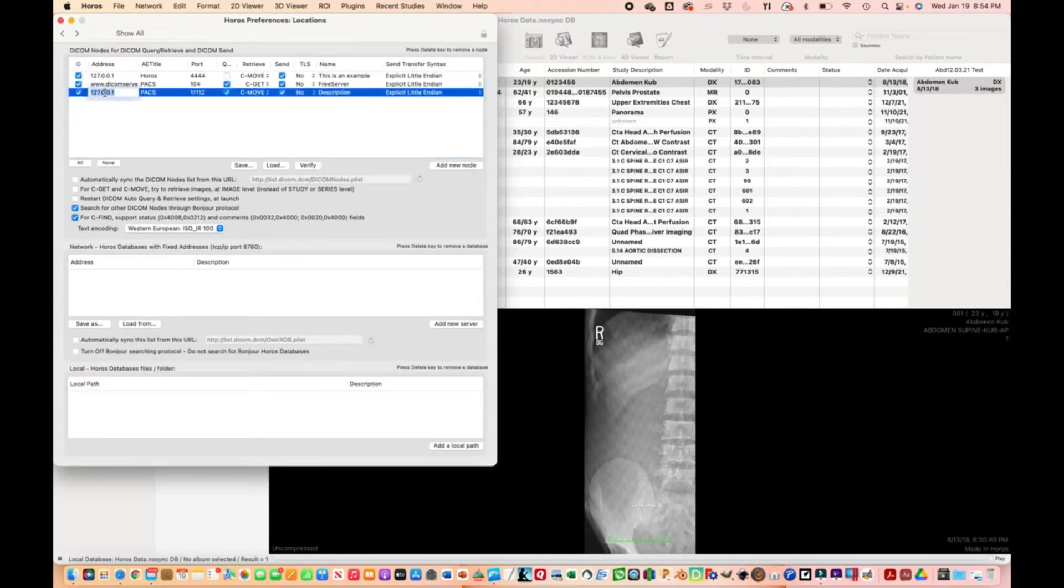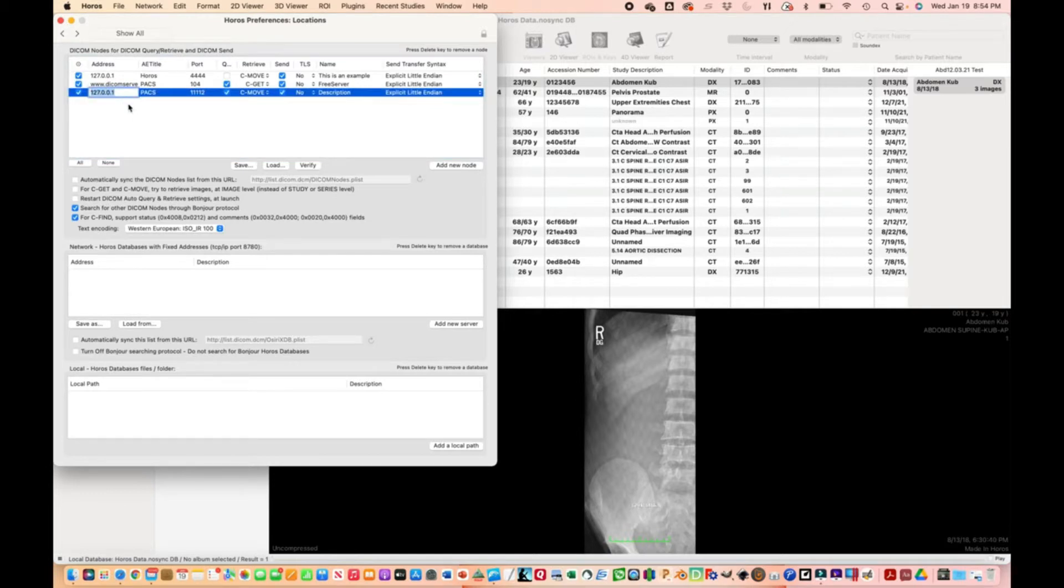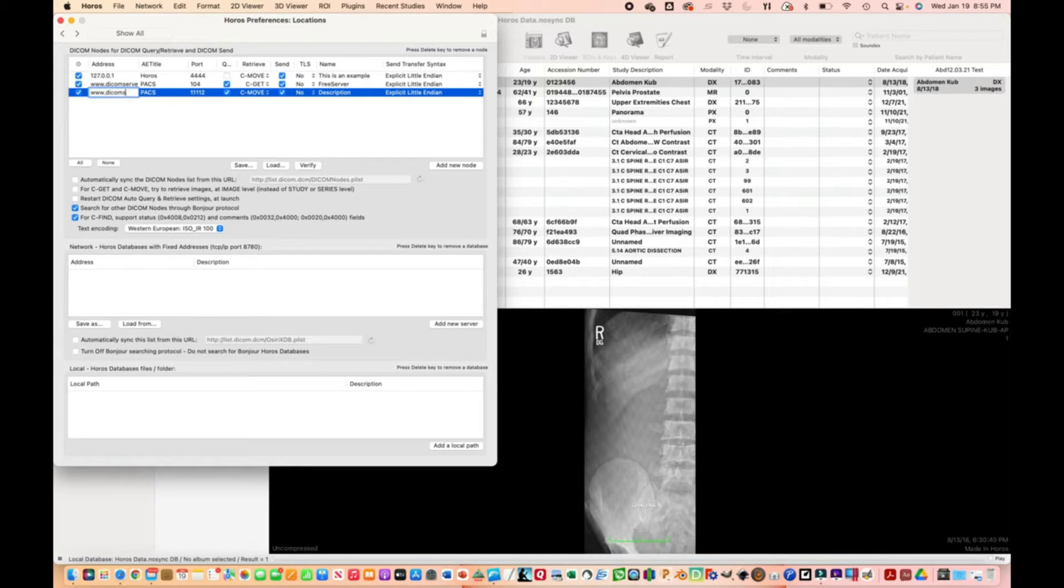Double click these items to edit them. This one is the address, so www.dicomserver.co.uk.